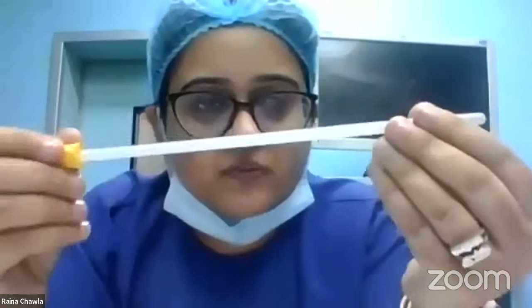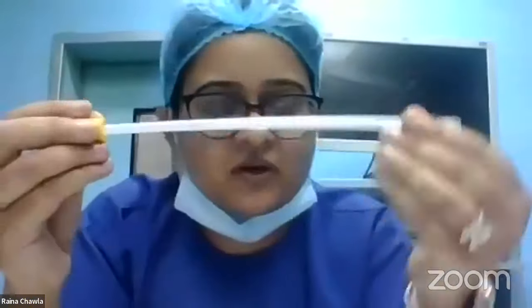While doing the suction evacuation with this cannula, we either do rotatory movements or to and fro movements while this is attached, but not too much beyond the internal os. If this is the internal os, this is the distance I need to go inside. Otherwise, it can lead to perforation of the uterus. So this is how a manual vacuum aspiration is done.